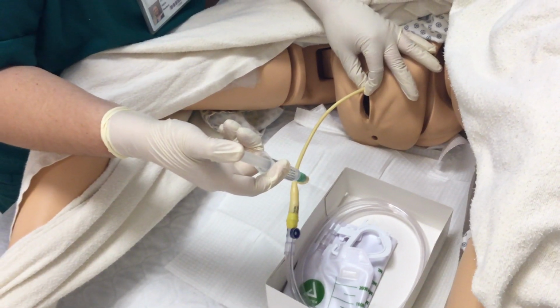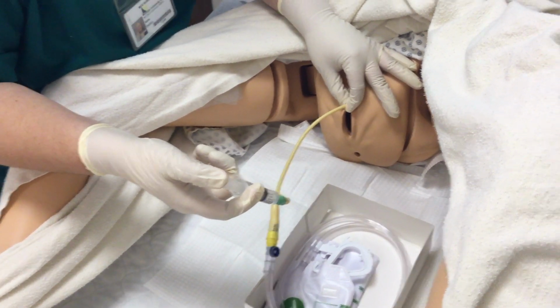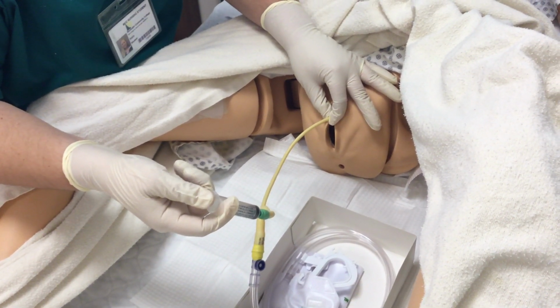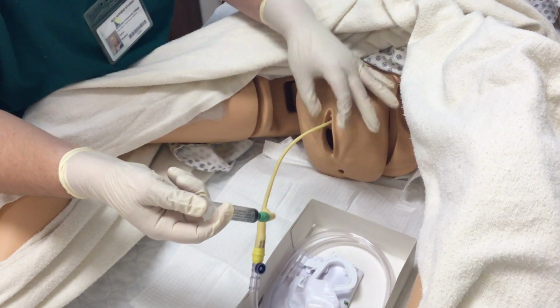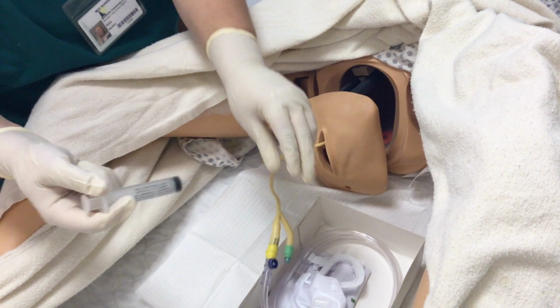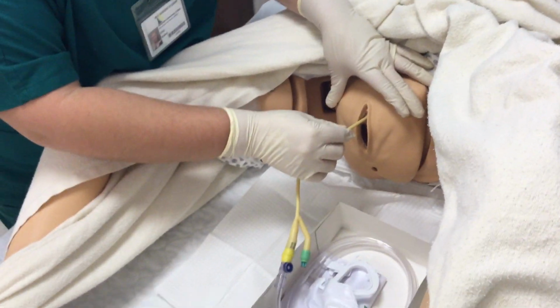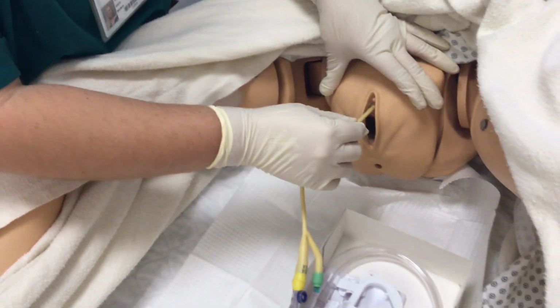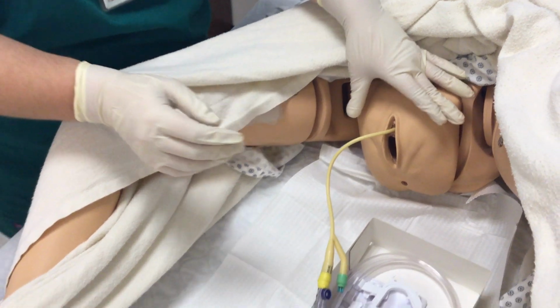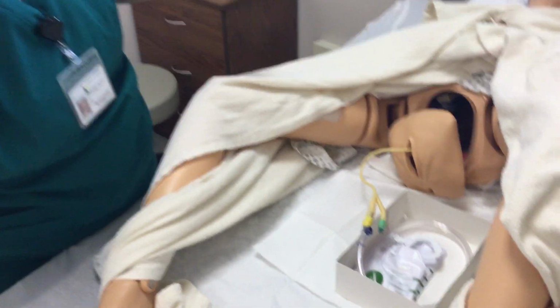So to begin the procedure, I'm going to come out. Want to be careful of this. Pull it back. So I want to open just the corner of it. This time I'm going to pull this out just a little until it meets resistance, and then insert it just a little bit more so it's off the bladder wall. Going to grab all my stuff and take care of it.